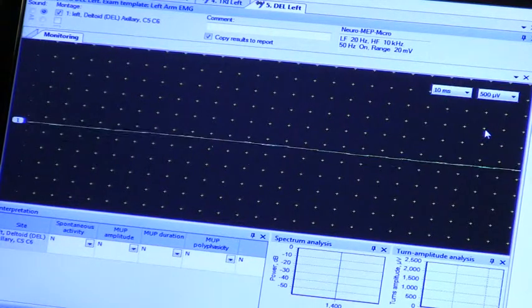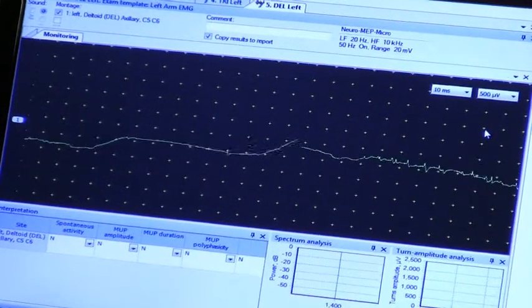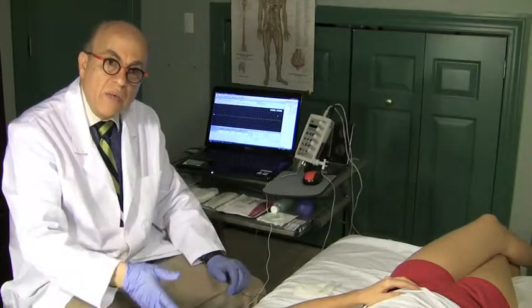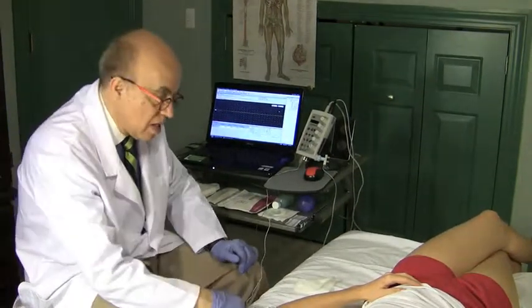Insertional activity. I get activity and it stops perfectly. If it continues after that, I'm either in the area where the nerve enters the muscle, or it's pathology — fibrillation and positive waves.